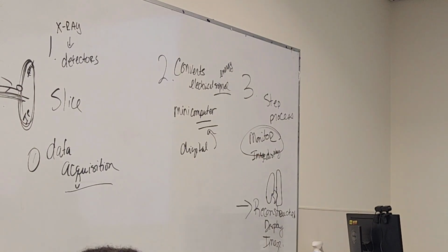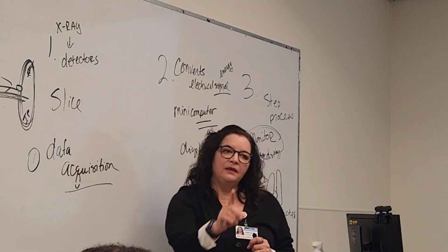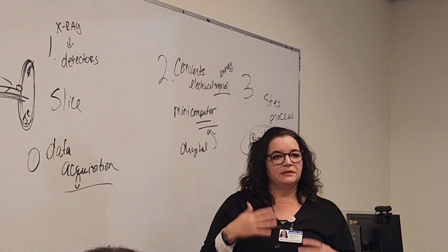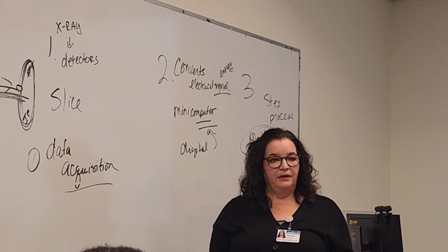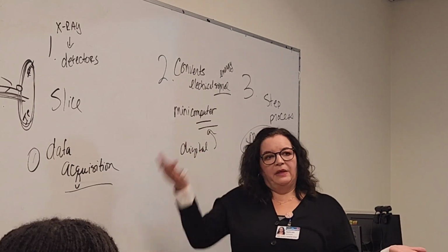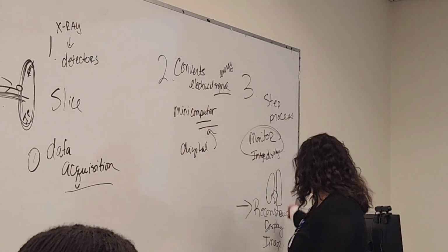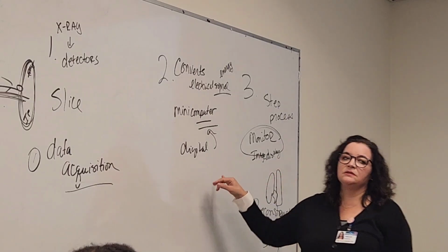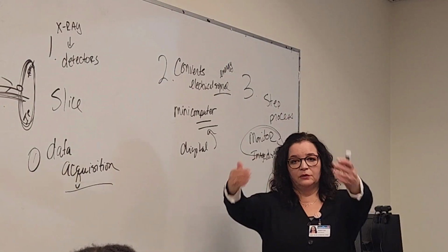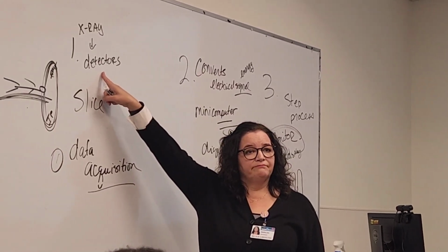We've gone over like 4 slides. But now we understand why CT is different than X-ray, right? Because it takes slices. Now we know the people that contributed to making CT what it is, right? Clinical introduction, mathematical formulas. We are taking axial images and we're creating any kind of image that we want in the image display. And these are the 3 sections that we're going to continue to talk about and flesh out little by little. So the rest of the units, all your chapters mostly, and the physics component are going to be talking about the types of detectors.